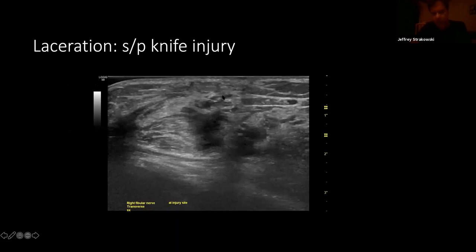And they had tried an MRI on him, and that's kind of what the radiologist felt, is it was just cut right down the middle. Here's the scar that gets deep into the lateral gastrocnemius. So there's clearly a lateral gastrocnemius injury. You always want to be careful that we don't try to overdiagnose anything from a still picture.